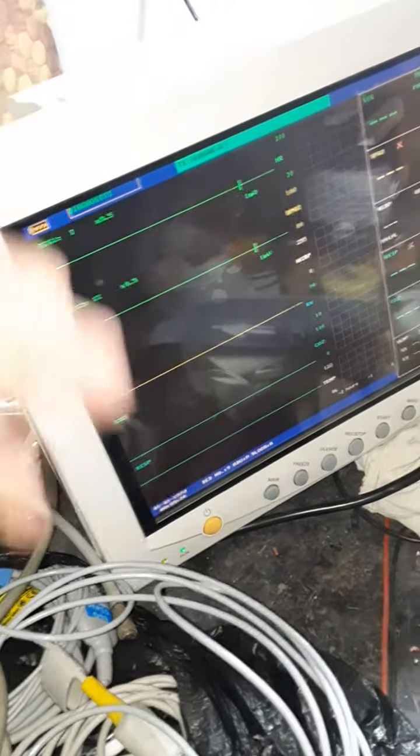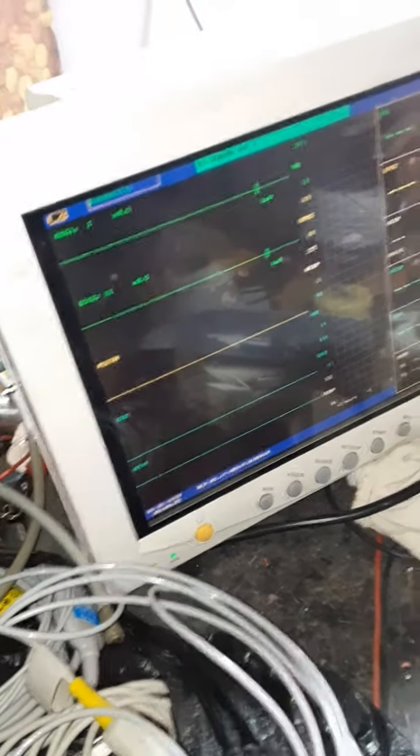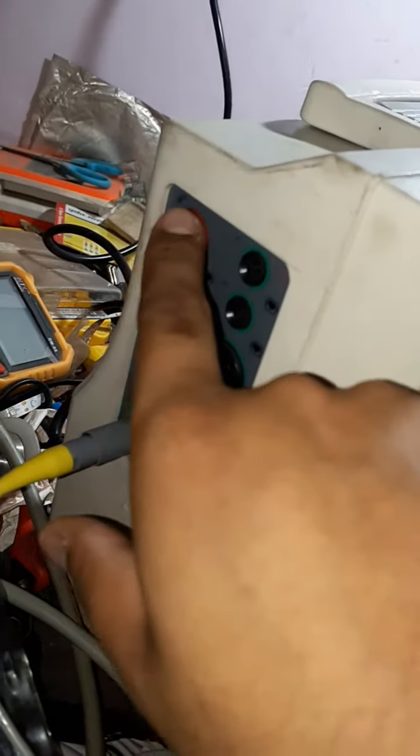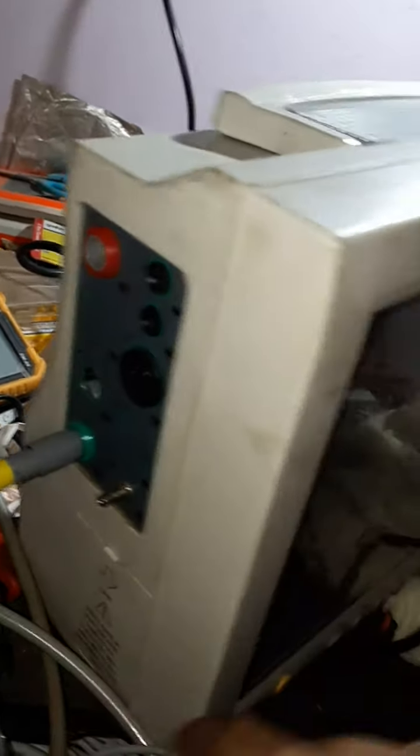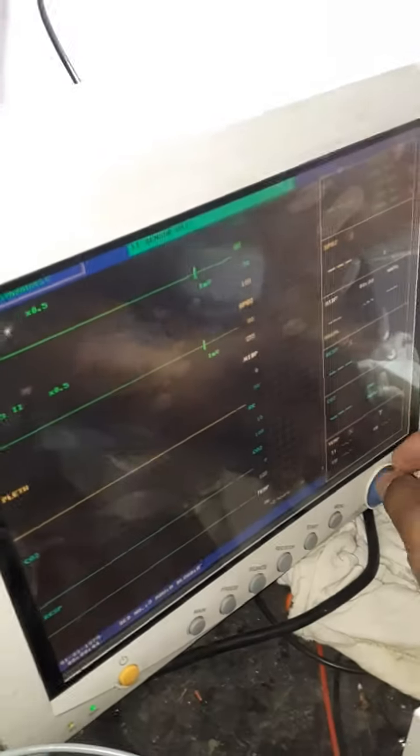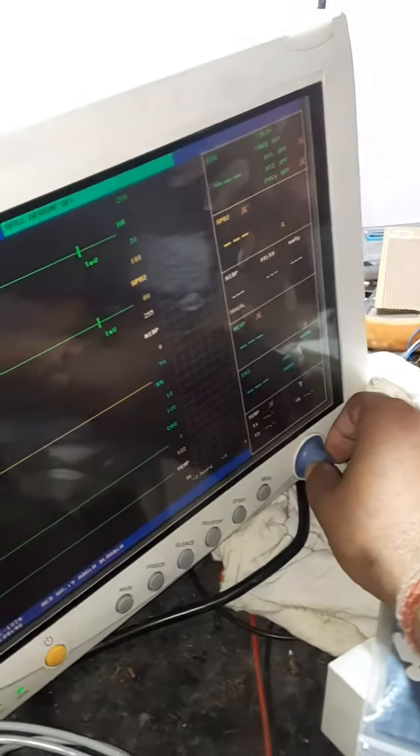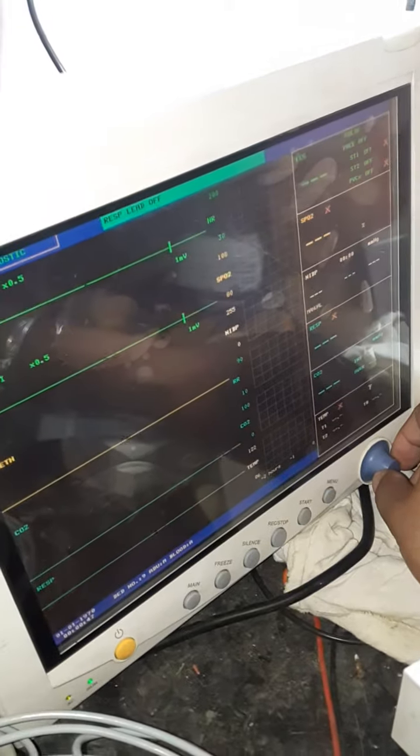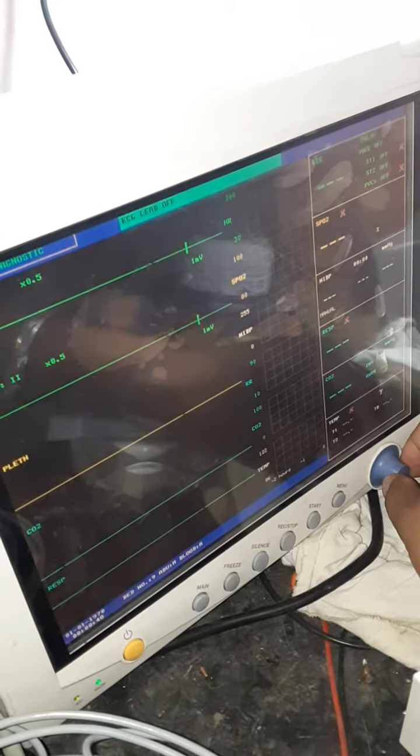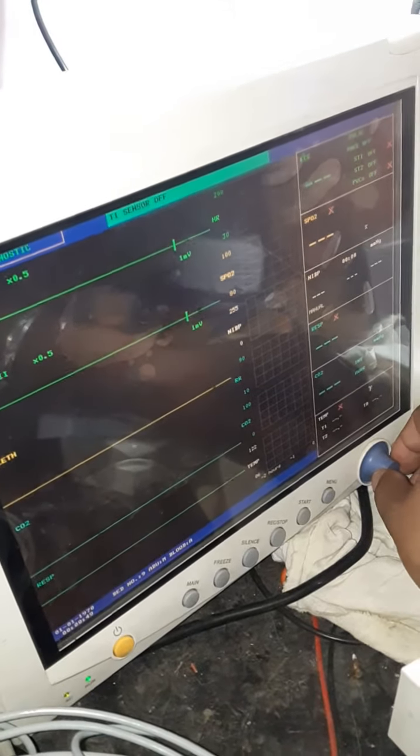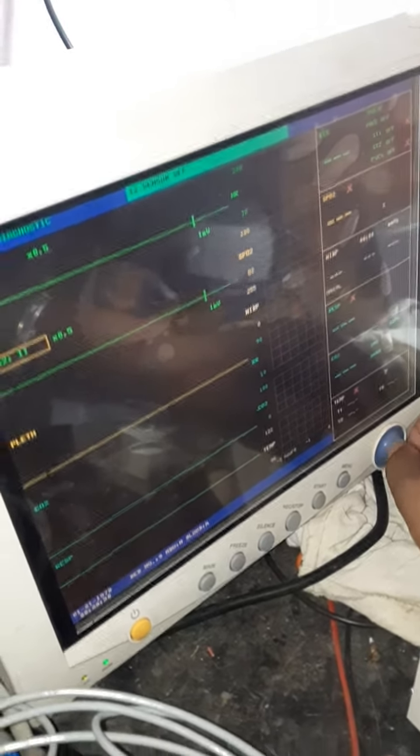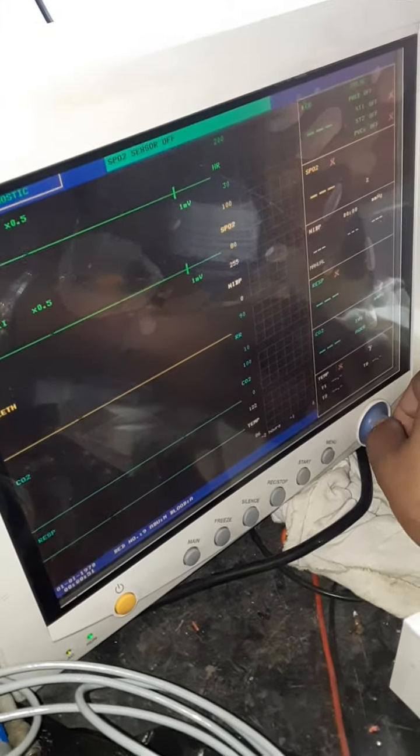If you have all the connectors - I have a CO2 connector, IBP, SPO2, all connectors - but your monitor is only showing five parameters, how can you change your five parameters to seven or six parameters? First, I'll show you the settings.